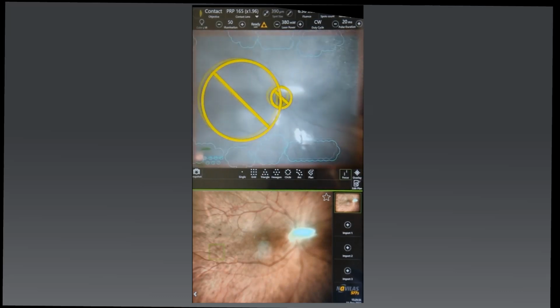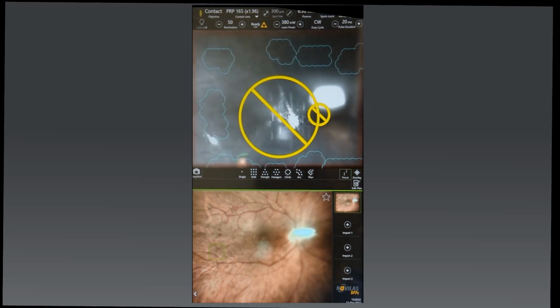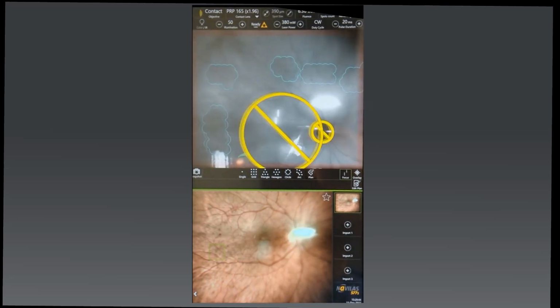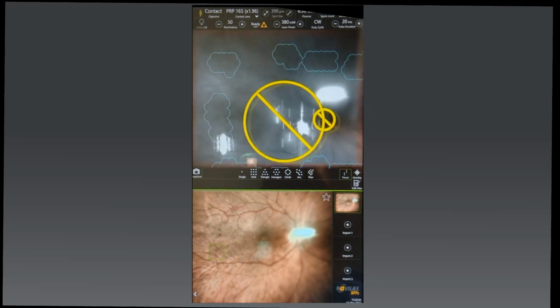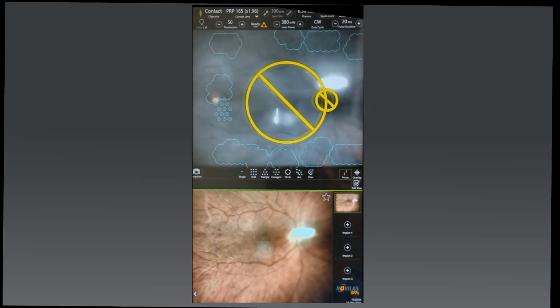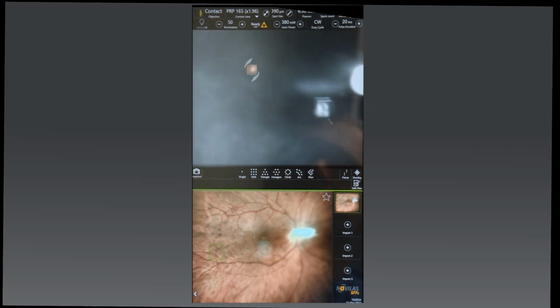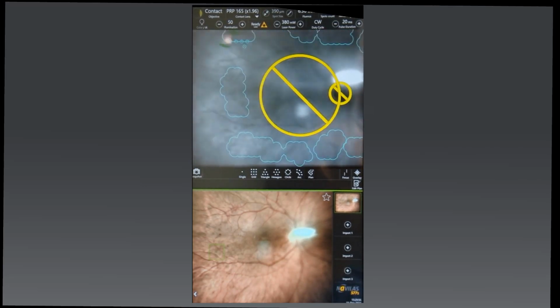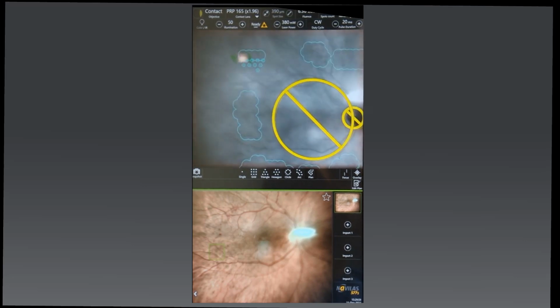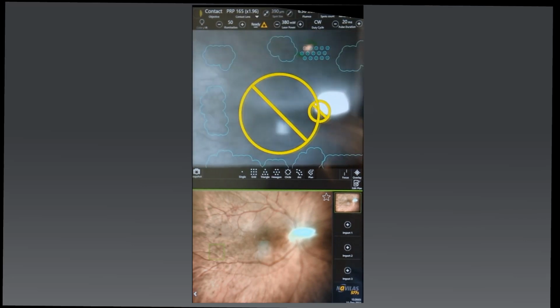What was quite apparent here, and you can tell, is that I'm able to just continue treating. He tolerated it remarkably well, and I'm quite sure that's the comfort feature, the infrared background illumination, that it's just much kinder to the patient. Even though you're doing fairly intense bursts of laser, they still seem to tolerate that much better than the background illumination with some other systems.